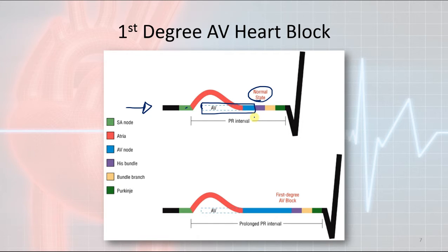hits that trigger zone. If you remember the trigger zone at the distal part of the AV node, it hits that trigger zone and then very quickly travels through the His bundle, the bundle branches, and the Purkinje network to allow for ventricular depolarization. And there's, of course, your Q wave, and that is traveling up there toward your R wave of the QRS complex.